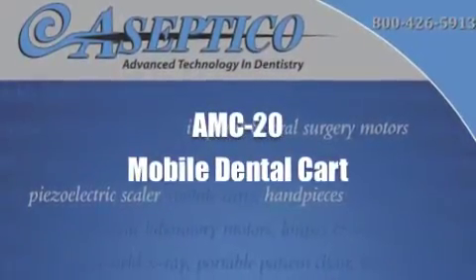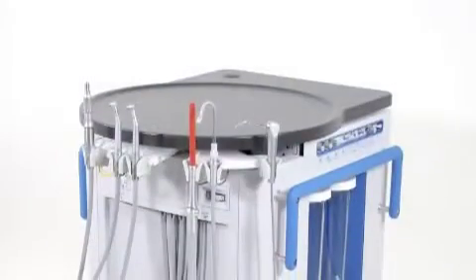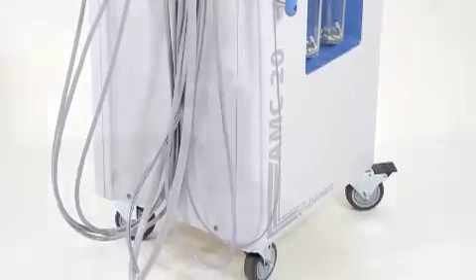The AMC20 Mobile Dental Cart from Aseptico — your no-plumbing operatory solution, featuring automatic handpiece connections, assistance instrumentation, water supply, internal air compressor, and powerful vacuum system.